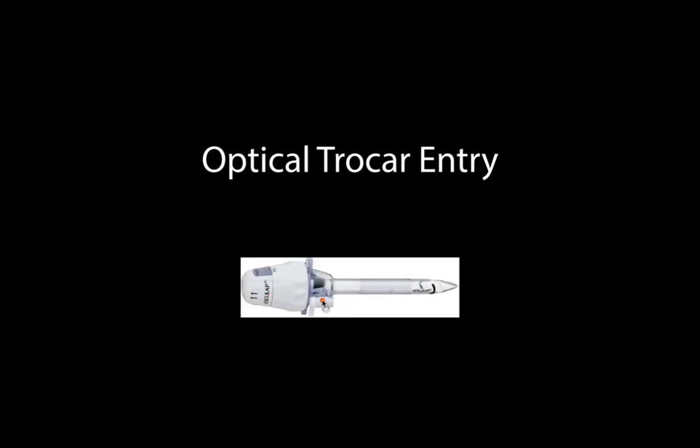When we're talking about optical trocars, those are typically five millimeter trocars with a clear sheath and a clear sharp end that allows you to go in through the abdominal wall. You can place your laparoscope in through here, facing through the pointed end of the trocar insertion device, and that allows you to watch yourself as you push and twist through the different layers of the abdominal wall so you can see exactly where you're going and hopefully avoid putting the trocar into any structures you don't want to damage.